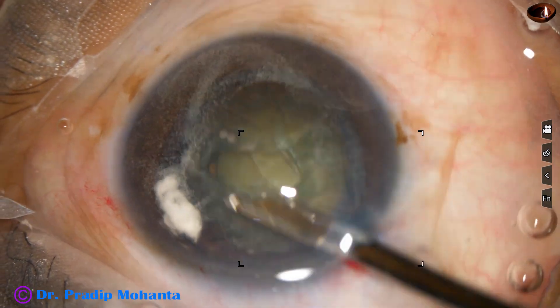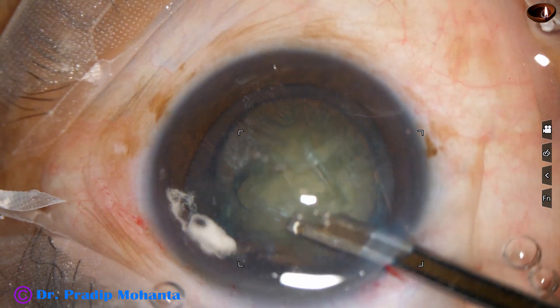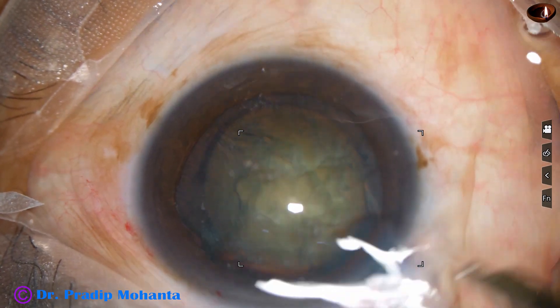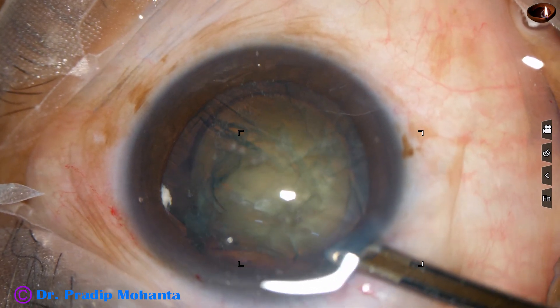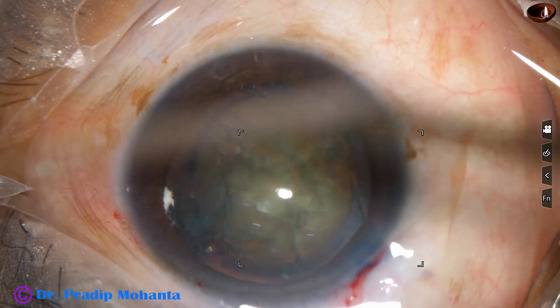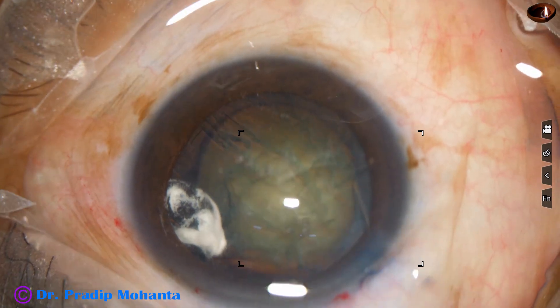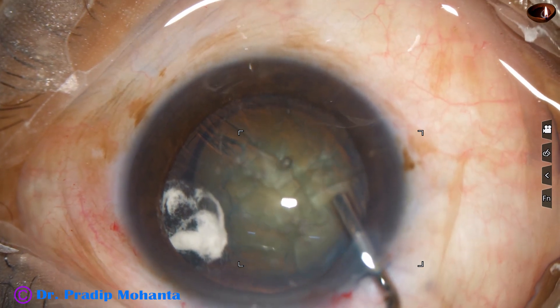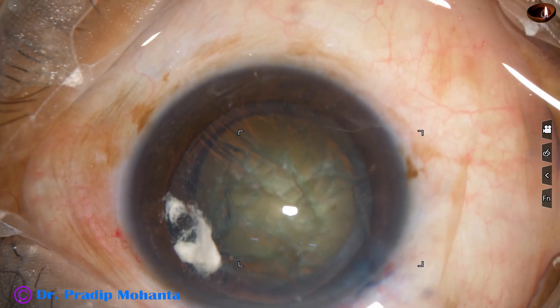As I use the Simcoe cannula to clean the anterior chamber, I find that a knuckle of vitreous is protruding into the anterior chamber. Once we press the surface of the cataract and fill the anterior chamber, it goes back. I inject some Viscoat and ask for a vitrectomy cutter.